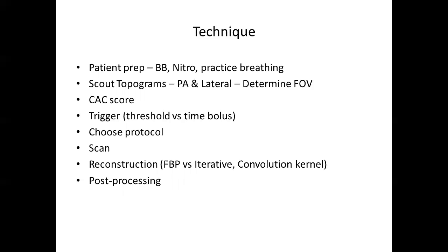Anybody who's above 40 and doesn't have prior stents or something where it doesn't make sense, we'll do a calcium score. And then people have different thresholds for deciding how high a calcium score we can still proceed with for the coronary CT. I think nationally 1,000 is an acceptable cutoff. Some of the Southdale guys will stop at 400. But I think nationally, most people agree you should scan at least up to 1,000.